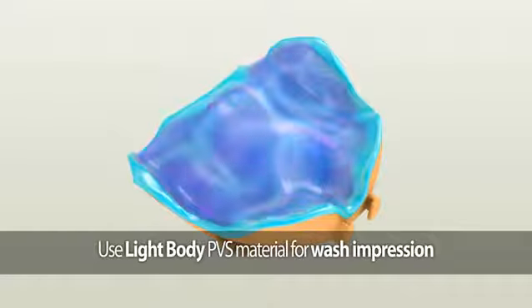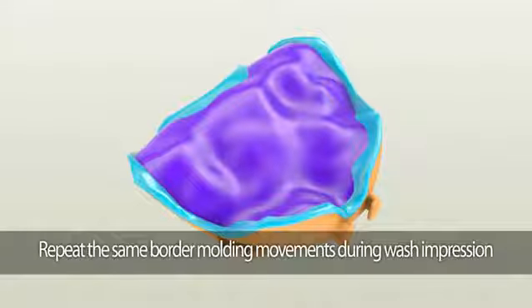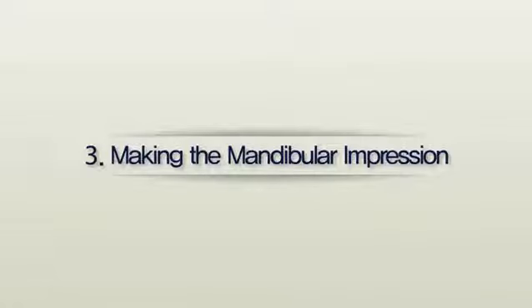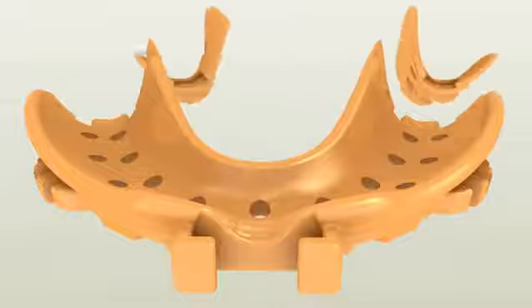To make the wash impression, we recommend using fast-setting light body PVS material. Lightly cover the entire area with fast-setting light body PVS material, then repeat border molding procedures.